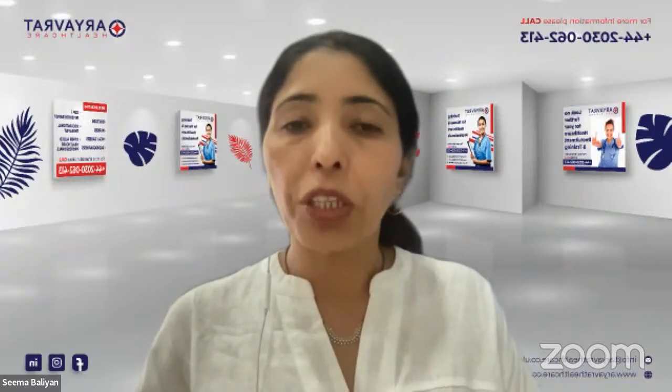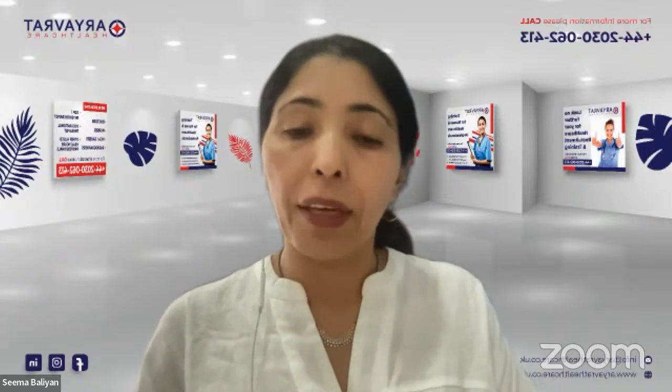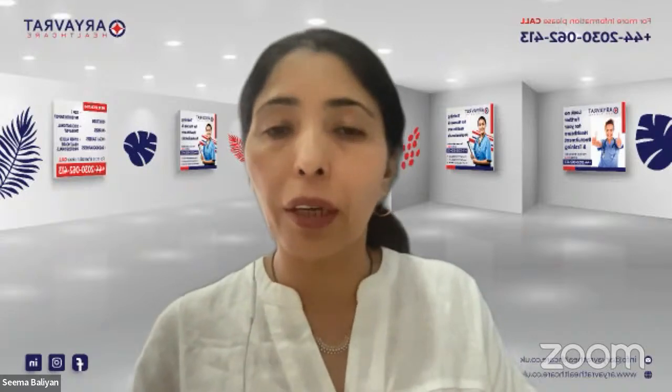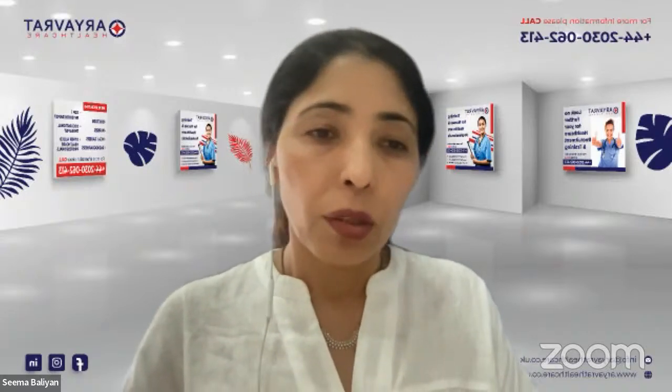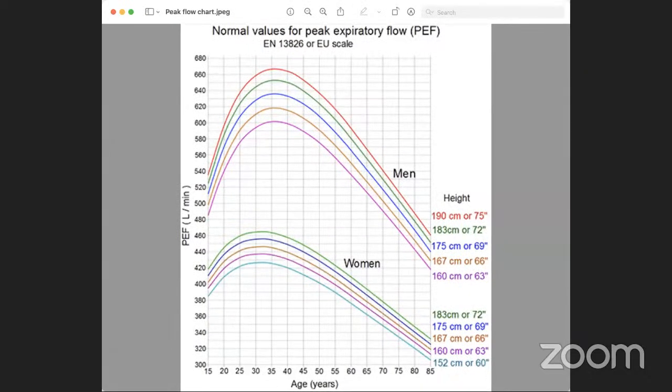Now I'm just going to be sharing my screen to show you what the chart looks like. And then we can figure out what should be the reading for Ash Potter. So if you just bear with me a minute. Okay, can you see the chart? Yes, ma'am.